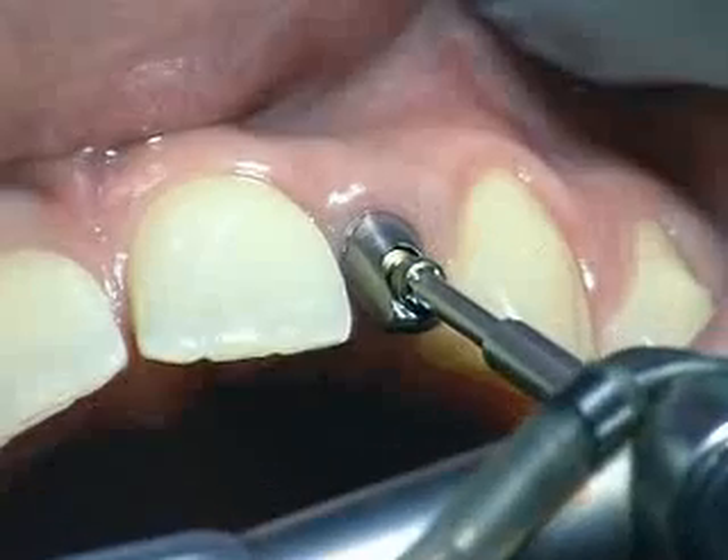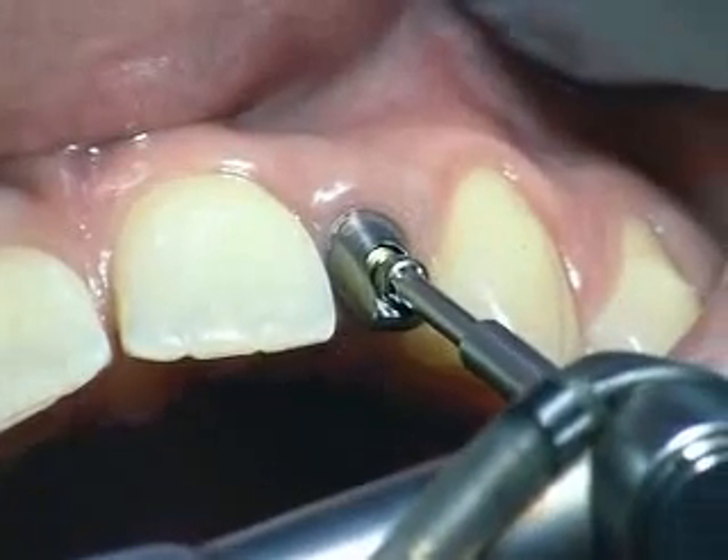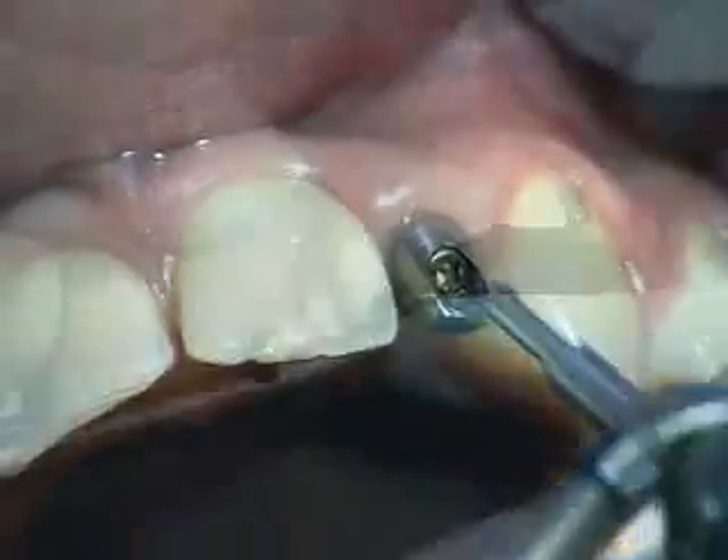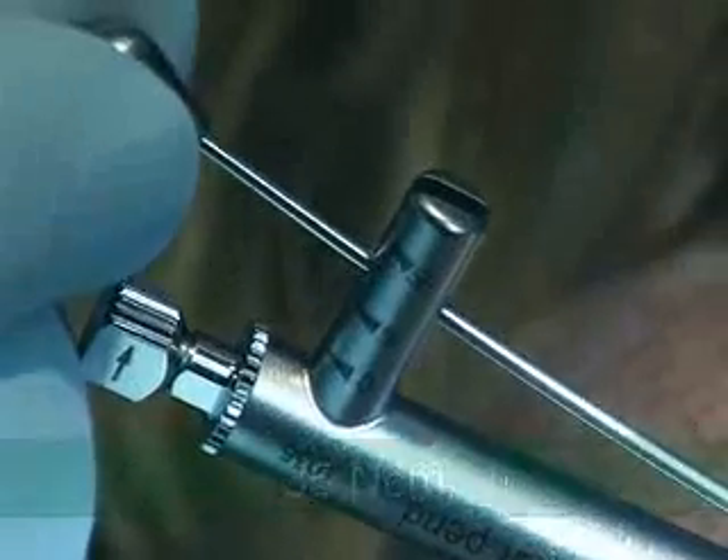The threading inside the implant is cleaned and dried, then the titanium frameworks are mounted on the implants and tightened with a torque wrench to a torque of 35 newton centimetres.